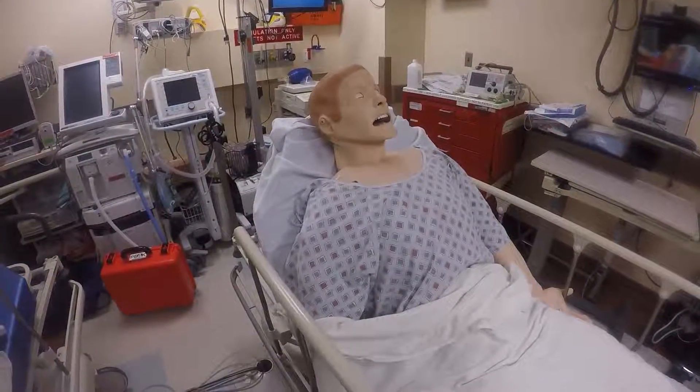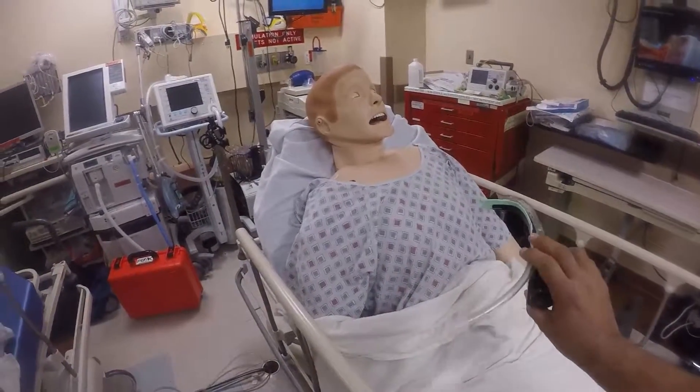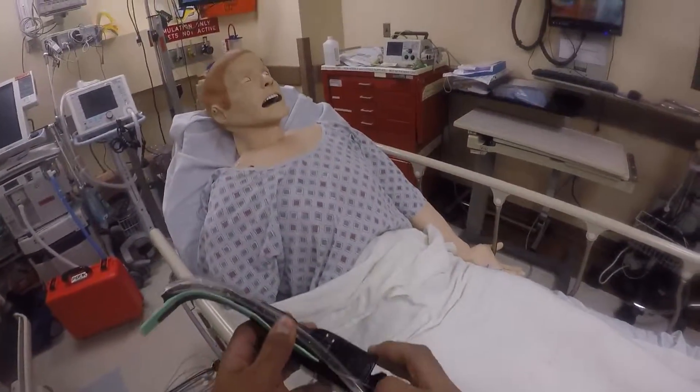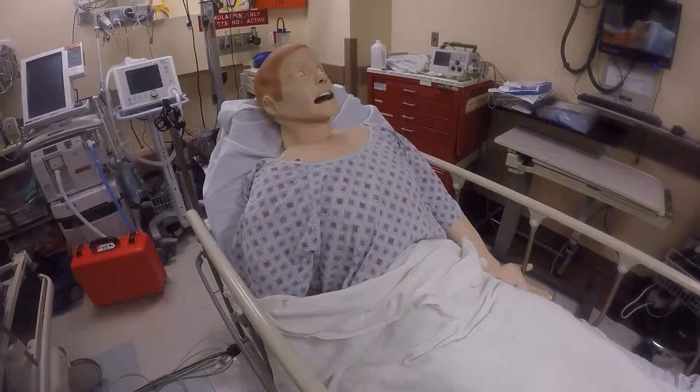Welcome back for another episode of School of Airways. We're going to use the Tomahawk method with a channel device. Whereas last time we used the King Vision, we're going to show you that you can do this with the AirTrex — one of the original channel devices.